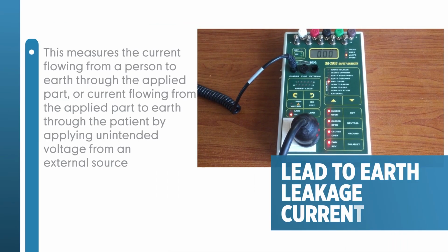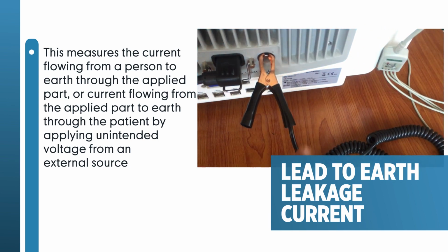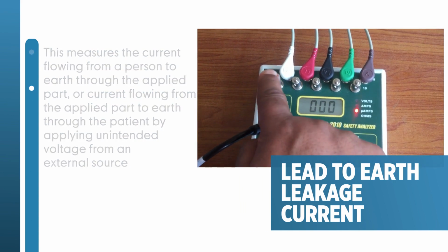Step 12. Lead to earth leakage current. This test measures the current flowing from a person to earth through the applied part, or current flowing from the applied part to earth through the patient by applying unintended voltage from an external source.